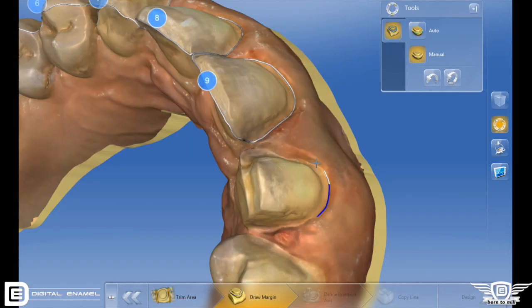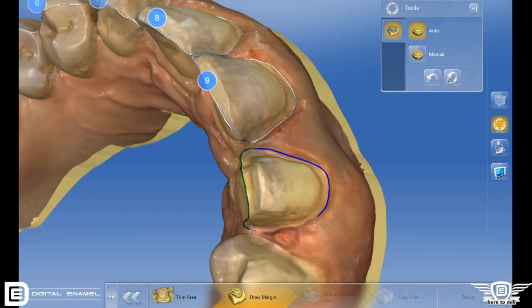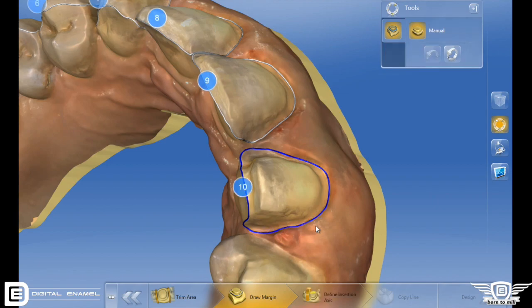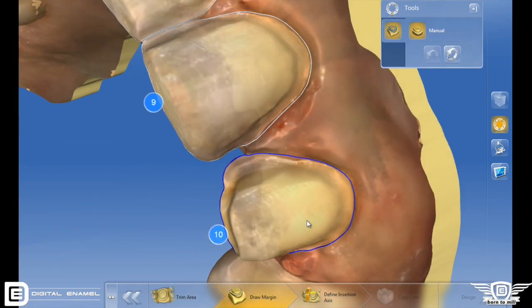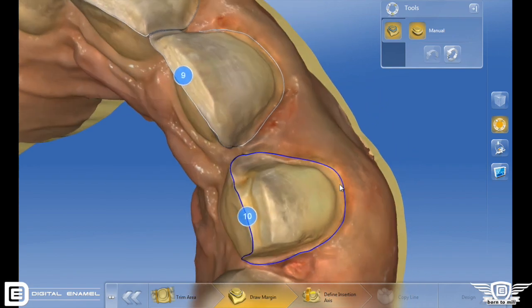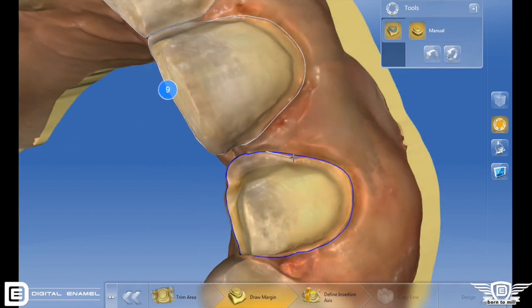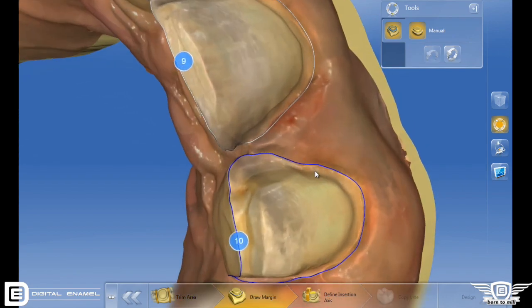The margination in the Omnicam has been greatly improved. The margin line has become much finer, and it determines the margin line even easier. Another really neat feature when you're marginating is that Sarek automatically puts the tooth number over the preparation, so you get a visual indication of what tooth you're actually working on.